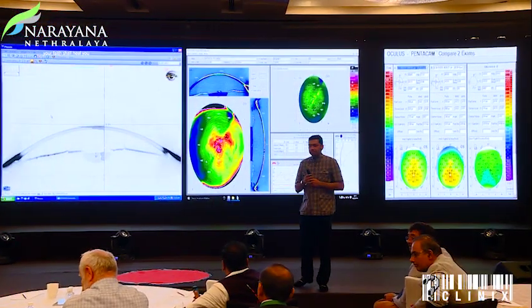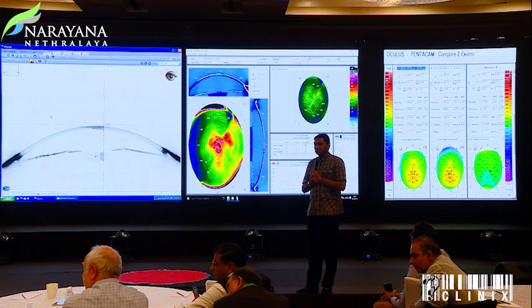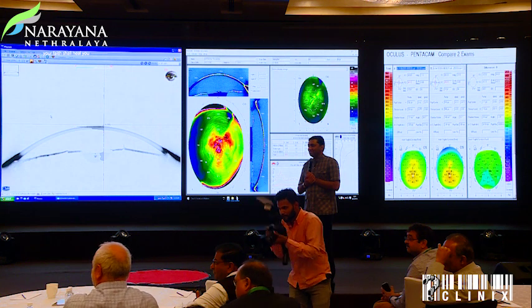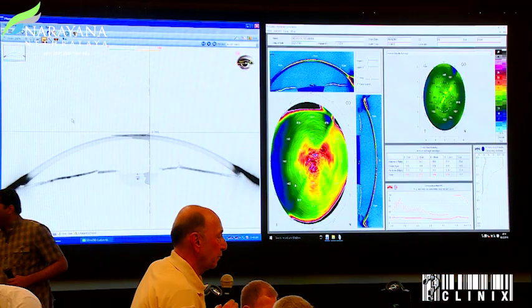Yes, please, ma'am. Professor Bellin, I had a question about when he was talking about artificial intelligence related indices. I wanted to know about the Pentacam random forest index that you've been working on. Okay, first, just to let you know, I have not been working on that. That's really Renato's work. It incorporates some of my early work with him.